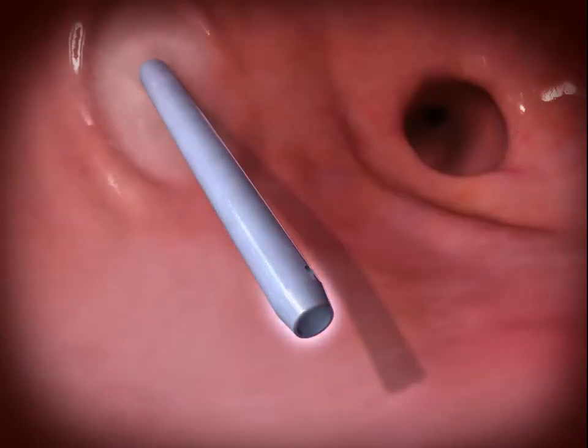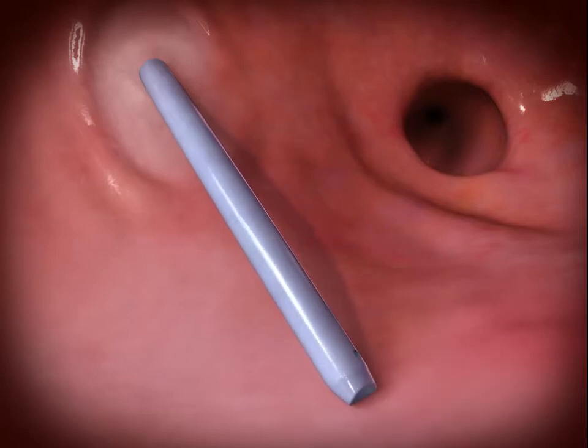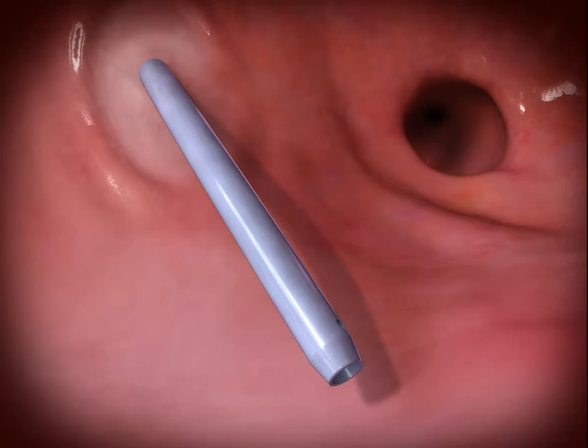The soft atraumatic tip reduces the risk of atrial wall perforation and has lubricious coating on both inner and outer surfaces.